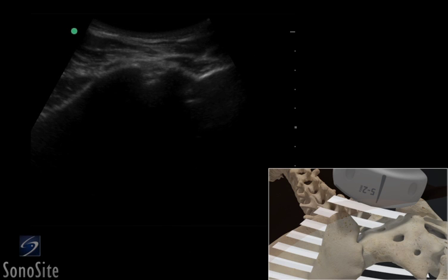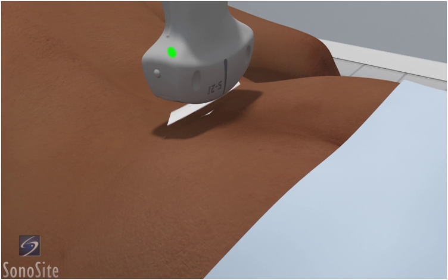A curved array transducer with a musculoskeletal exam type is used to perform an ultrasound-guided injection of the sacroiliac joint. The patient is in a prone position.